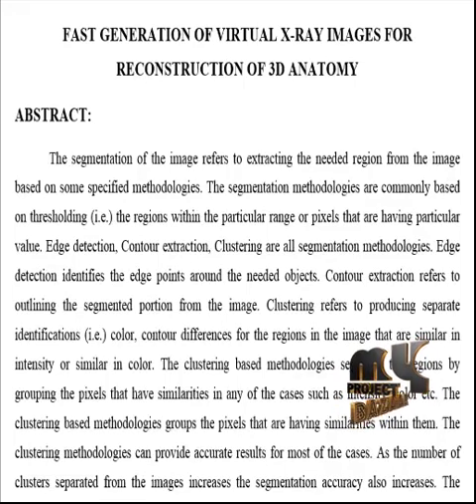The images are initially pre-processed using median filter and adaptive histogram equalization. The median filter replaces the identified noisy pixels in the image by calculating the median of the neighboring pixels. The pre-processing step is the basis of all image processing. This process makes the images have the same range of intensities in the whole image. Discrete wavelet transformations were applied to the images in order to make the clustering process robust to noise.